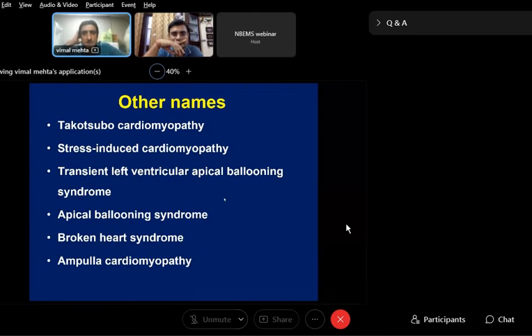And what is the prognosis? We saw that. I want people to answer what the prognosis is and what the presentation is. How will they present actually? Let us say somebody says it's a good prognosis. I mean, how good? Do all of them recover? Yes or no? Somebody unfortunately has a fatal event, presenting as arrhythmia, embolism, acute heart failure. Very good. But most important, you have not told me.